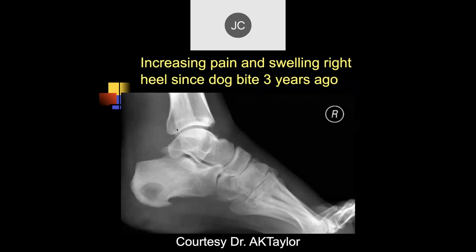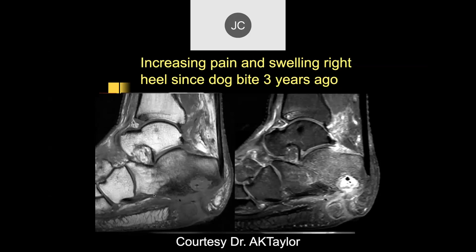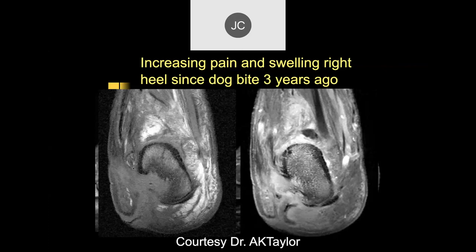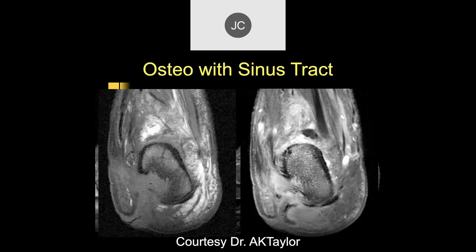Increasing pain in the right heel. There's a lucency in the posterior calcaneus with sclerotic margins, the fat pad looks a little dense, and there may be a little air in the soft tissue. On MRI, there's a lot of destruction of the inferior calcaneus, gas visible here from a draining sinus, and a big abscess within the bone with chronic eburnation due to chronic inflammatory reaction. The cortical destruction and draining sinus tract are clearly visible — this was osteomyelitis with a large sinus tract and abscess.